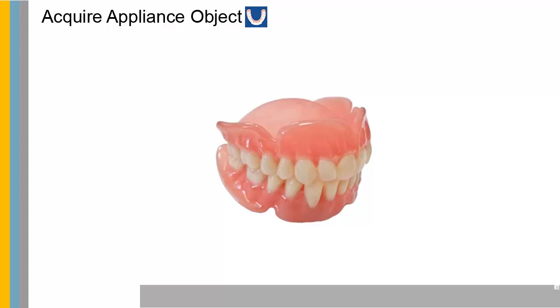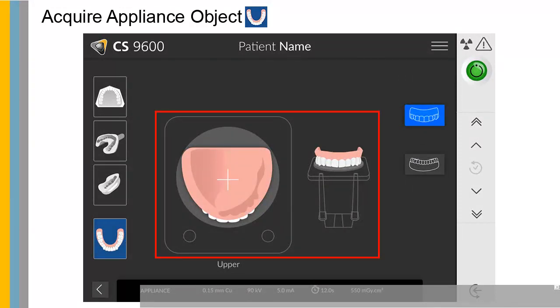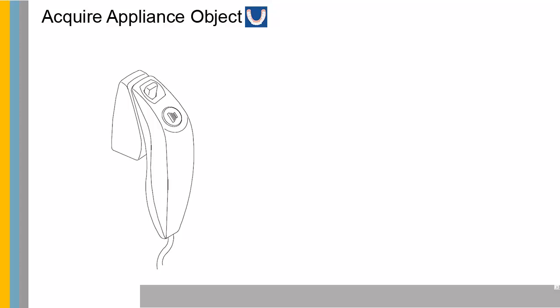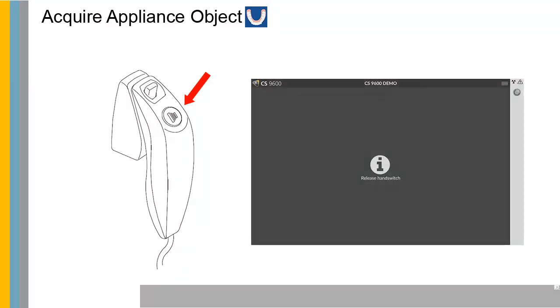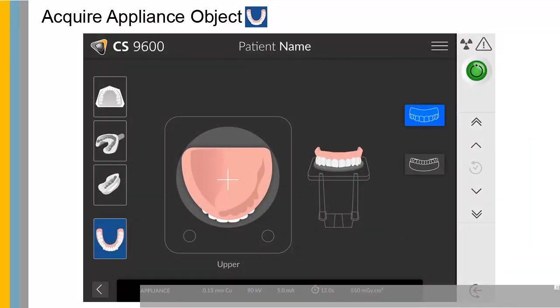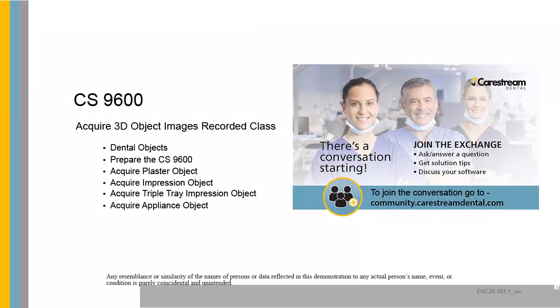Click to launch the appliance acquisition. Select either the lower jaw or upper jaw acquisition mode. See the on-screen illustration on how to position the appliance at the center of the black foam. Place the teeth of the appliance on the black foam in the same orientation as when you remove it from the patient's mouth. Launch the X-ray with the remote control. Press and hold the exposure button until the end of the acquisition is indicated by the on-screen release switch message. When the acquisition ends, the acquired image appears on your screen. Repeat this process for each object. This concludes the CS9600 Acquire 3D Object Images recorded class.